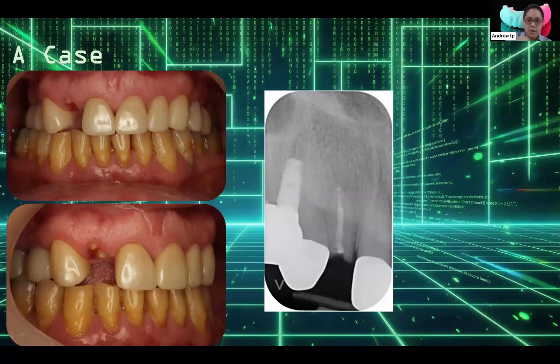So we'll go through a case, and I really like this case. I think Hog actually showed a part of it earlier. This is a continuation of that particular case, because this patient ended up having some crowns, and one of those crowns basically fractured at the gum level, which of course is a very unfortunate and very stressful situation for everyone involved.